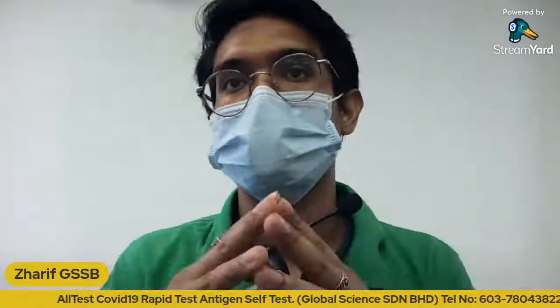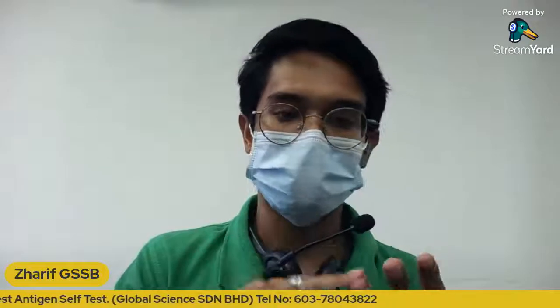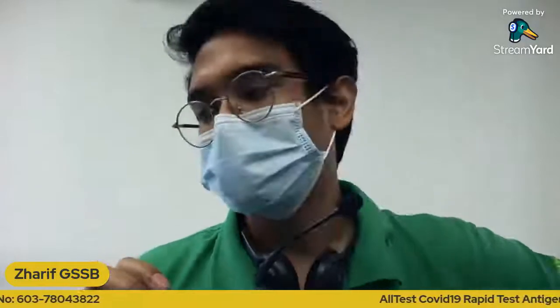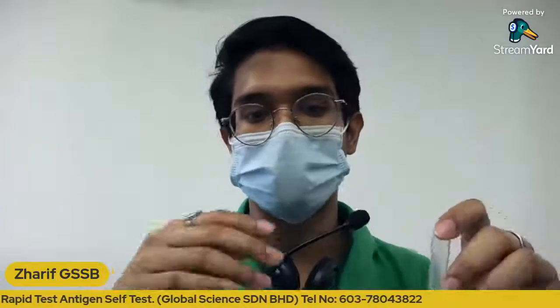The first thing you need to do before you begin the test is make sure you haven't eaten, drunk, smoked or vaped anything at least 10 minutes before the test. To simplify, it's just a short fast before you do the test, to make sure that when you extract your saliva, it doesn't contain any residue from the food or drinks you have consumed.